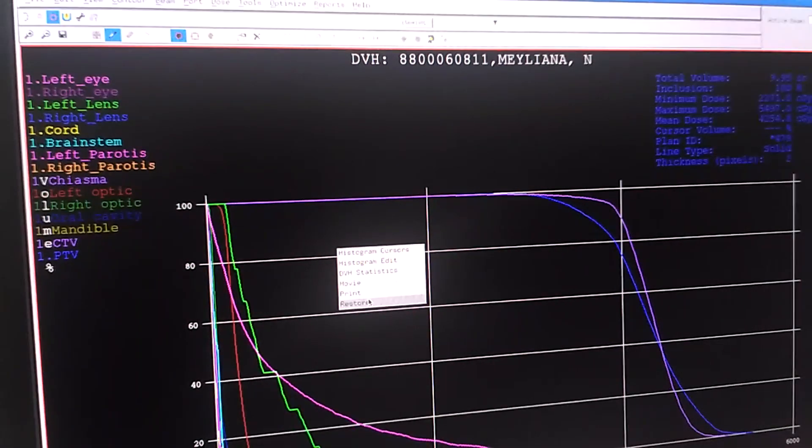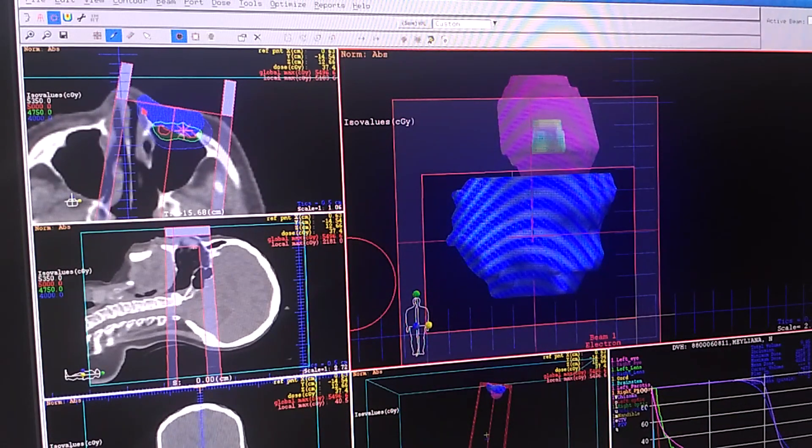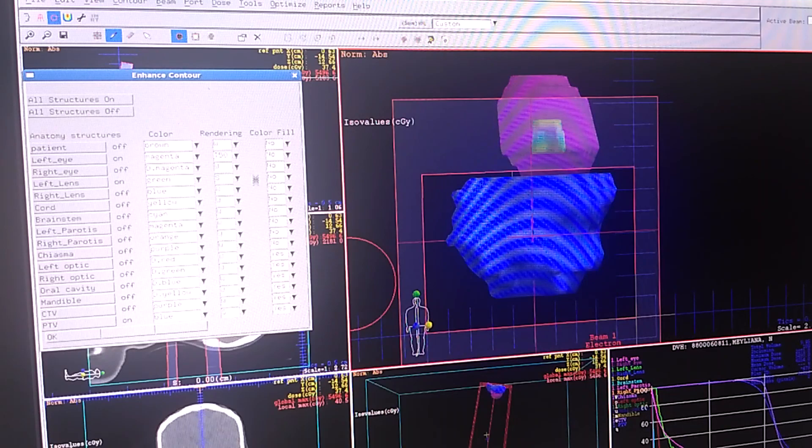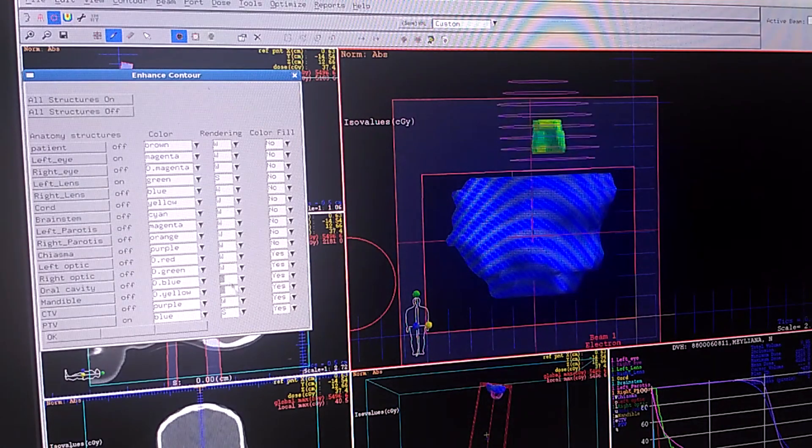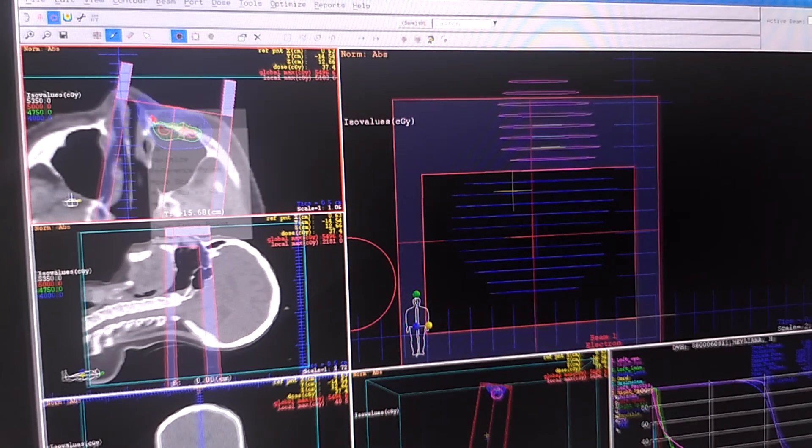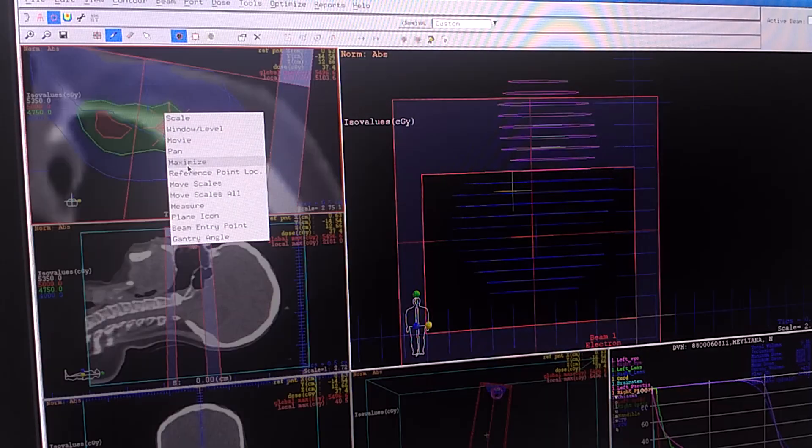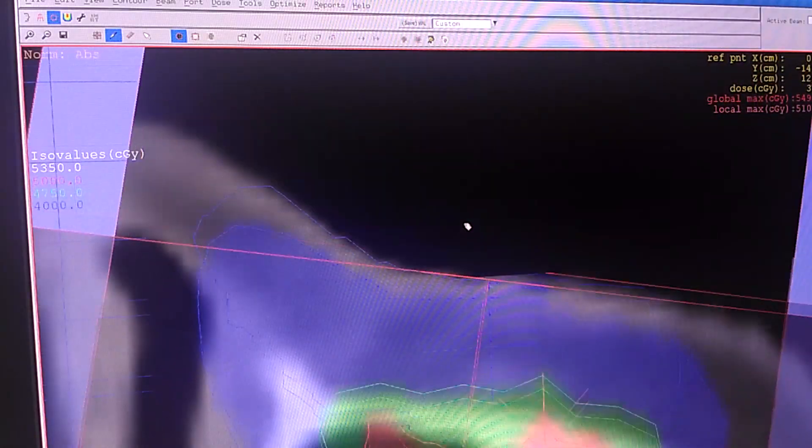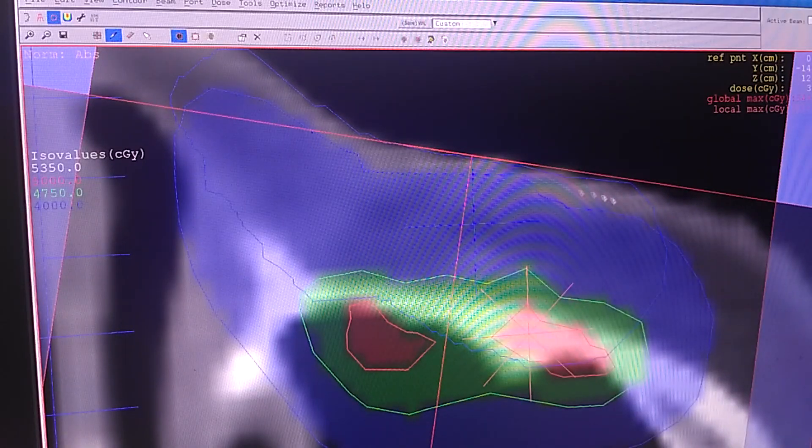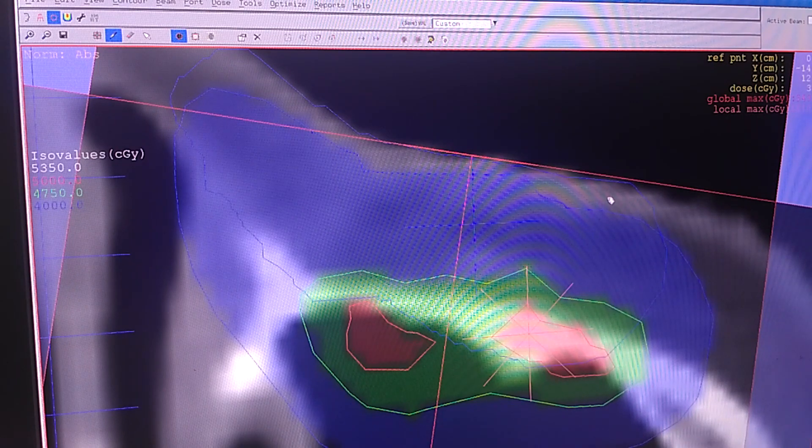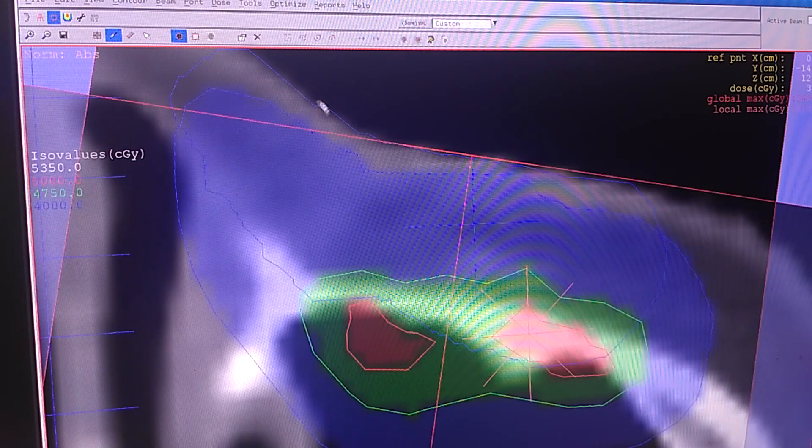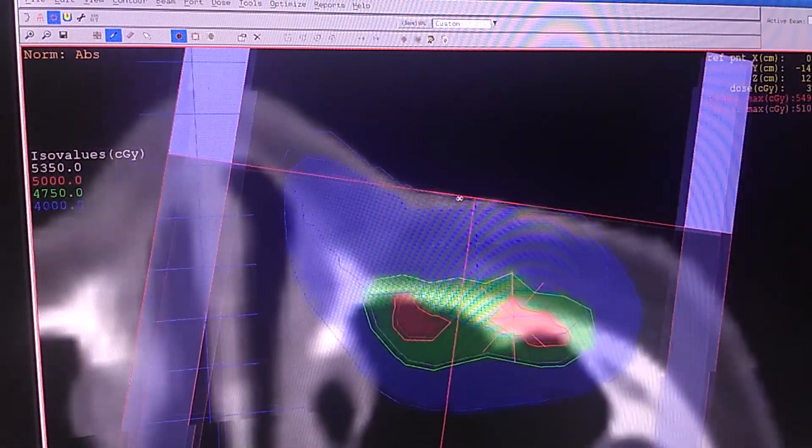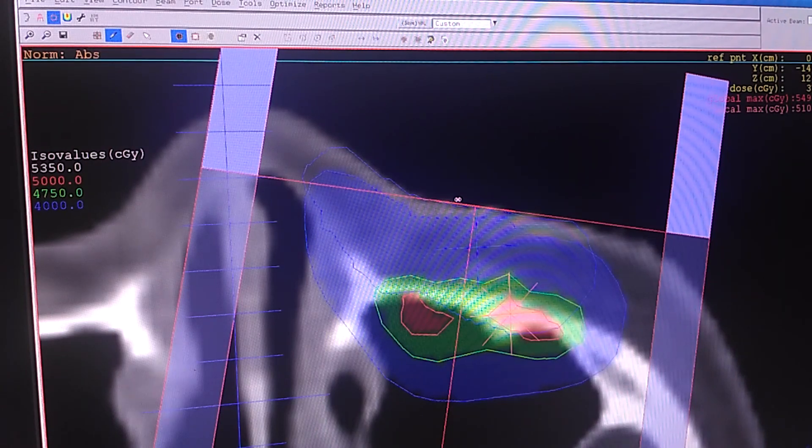The next step we can do to optimize this one is using a bolus. I'm going to change the rendering again. You can see here the dose is not really upper into the skin and then we are going to use bolus to make the dose going upper.